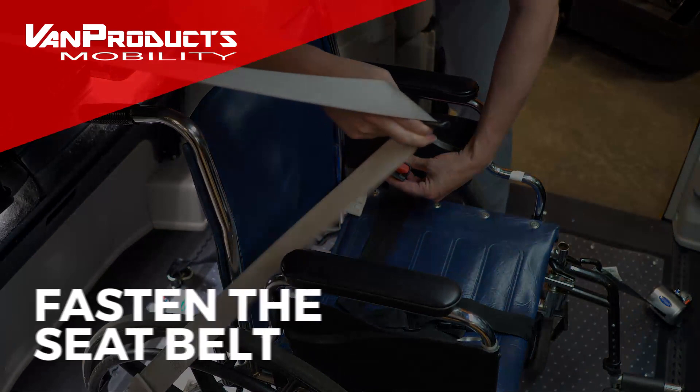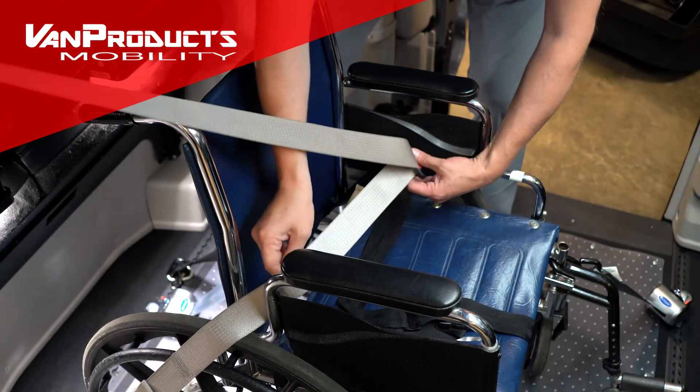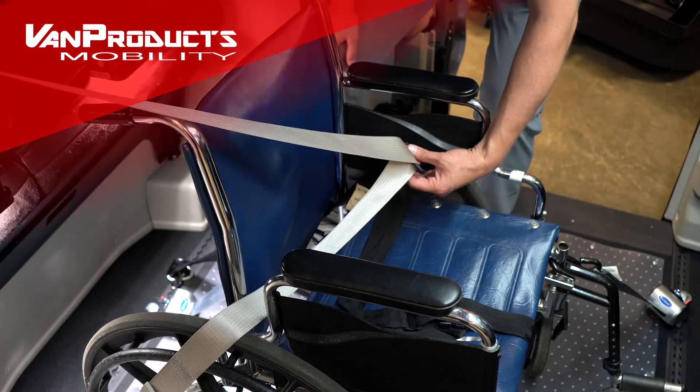The lap belt portion is secured to the floor. Then you use the seat belt on the wall to secure the passenger.